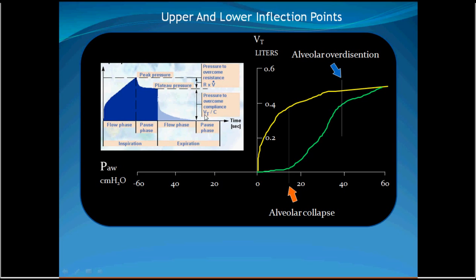So we have to take care of this tidal volume I mentioned before. An increase in tidal volume will be associated with an increase in the plateau pressure, which might lead to rupture if it is more than 35 centimeter water. If you are using pressure controlled ventilation, this is normal. This is the inspiratory resistance and the flow. This depends on the flow and inspiratory resistance, usually about 10 centimeter water. You add 10 centimeter water to the 30, this means 40. You should never exceed 40 centimeter water in pressure controlled ventilation in order to avoid rupture of the alveoli.